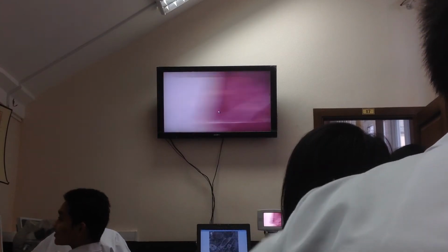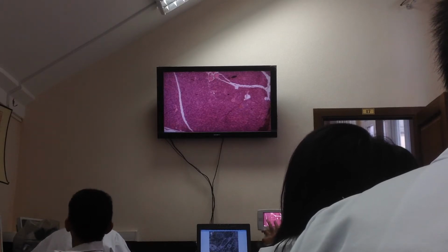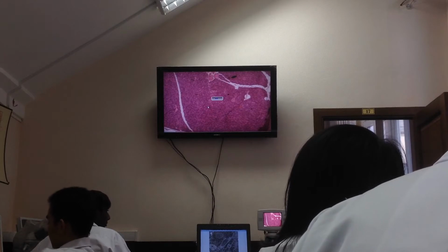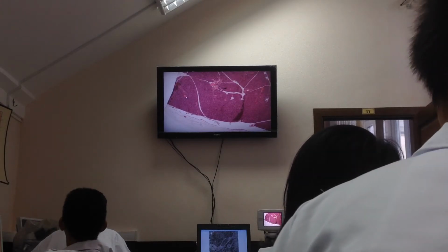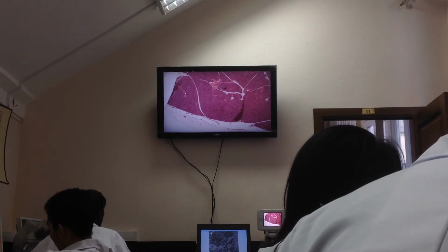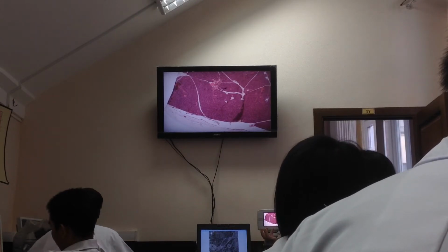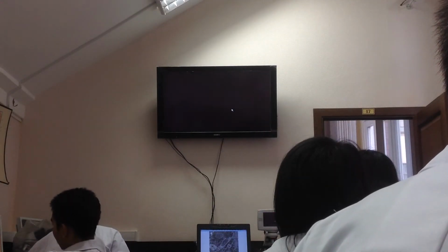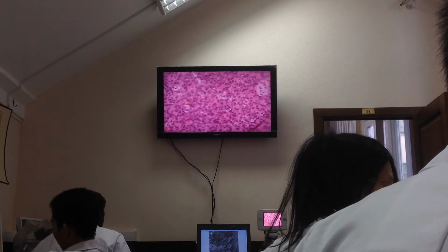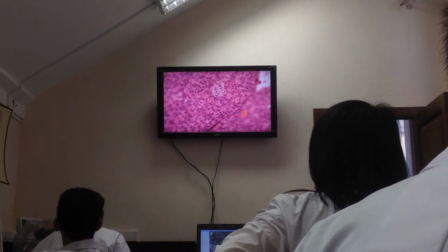You can move the section and try to differentiate the structures. What is this? See? Less color. It's the lowest magnification. Now zoom in. Don't confuse with blood vessels containing erythrocytes. Blood vessels are orange. Here, groups of cells are less colored. Zoom in. Islet. Zoom in more. At high magnification, these islets are better visible.